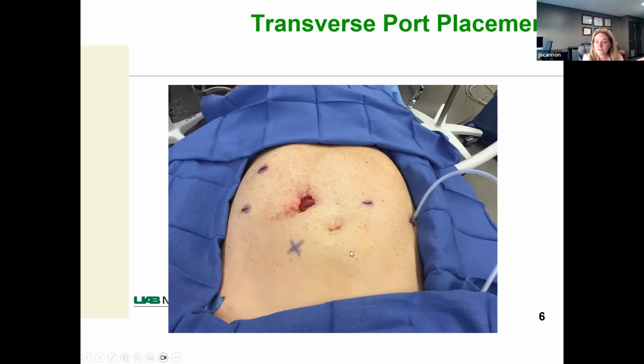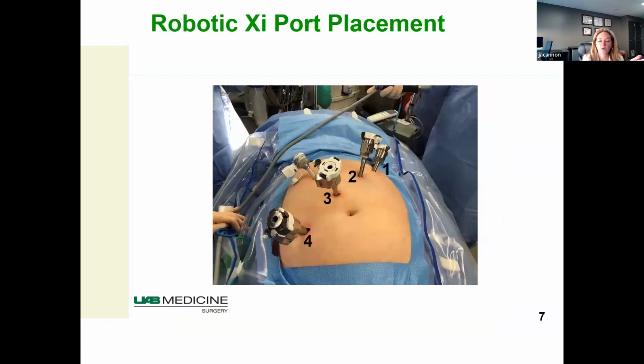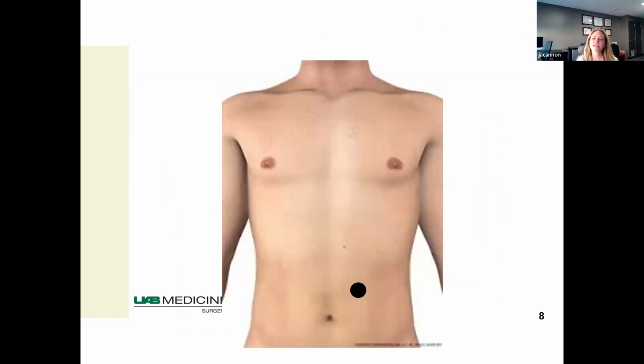However, the Xi is very forgiving, so we generally take into consideration where their colostomy is going to be. So obviously this is a permanent colostomy, so its placement is absolutely crucial. It's very important that all these patients are marked preoperatively and that you've decided where the best placement for their ostomy is going to be. And I will generally plan wherever they've been marked for their ostomy for that to be our 12mm trocar site. So that's where we will staple from.